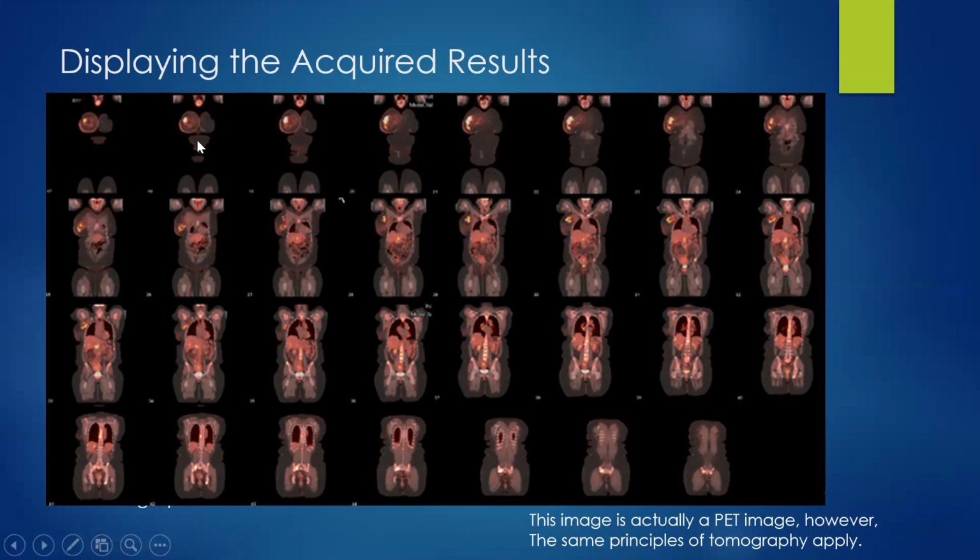And you look at these tomographic slices, you can actually see the breast tumor right here as you go across. And you can also see other areas that actually have metastatic disease. I believe this looks like it's probably in the liver. It looks like maybe we have some metastatic disease in the bone. Looks like we have some metastatic disease in the spine. Very unfortunate for this individual.